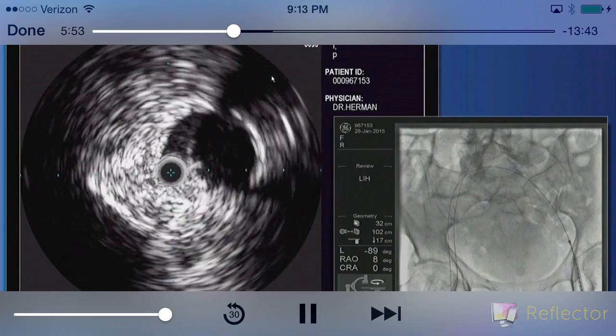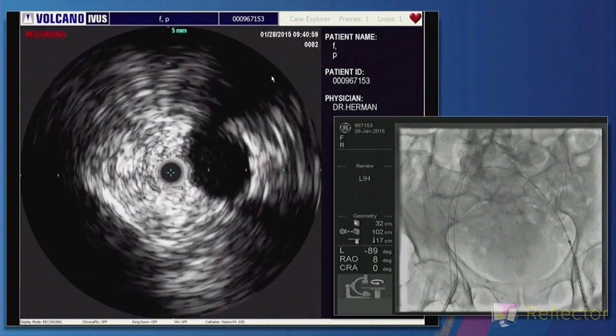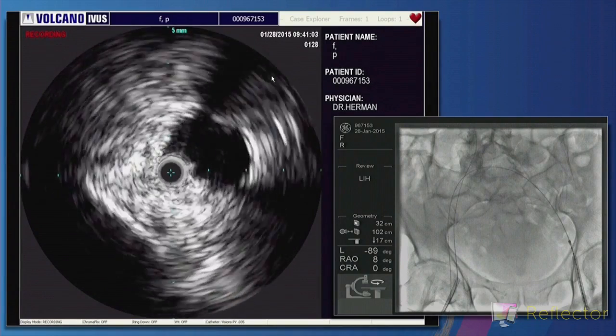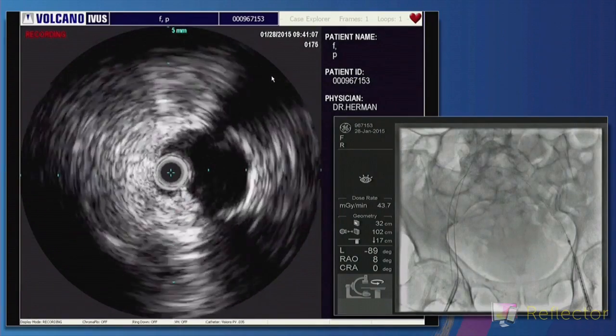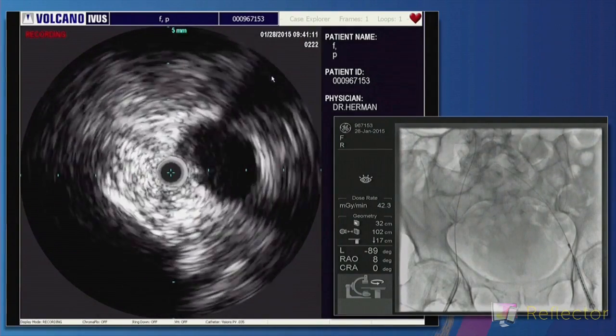That's why we want to be sure we always open it up in the inferior vena cava, without any compression or stretching of the vein, because you can make the vein any diameter. So let's do that right now. I'll pull back this wire. We have bilateral access, so that's not a problem at all, and if we want to treat that side, we can do that.